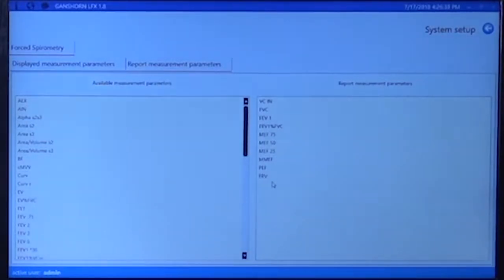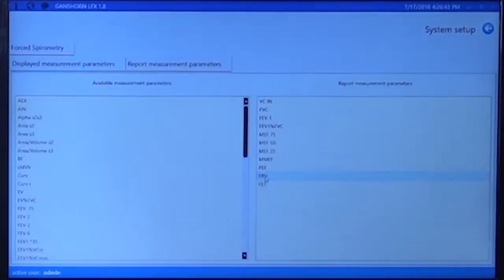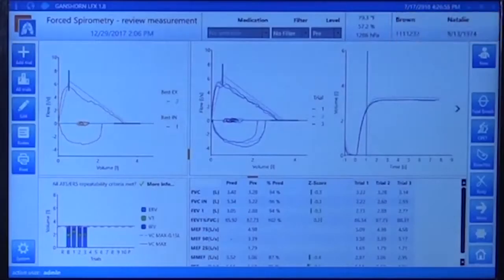and Print. Once we go to Print, we will have the automatic export of the file as a PDF, so that we can preview the report before we print it. Once we have the preview of the report, we can see exactly how it's going to look at the moment of printout. Every field in this report can be edited.